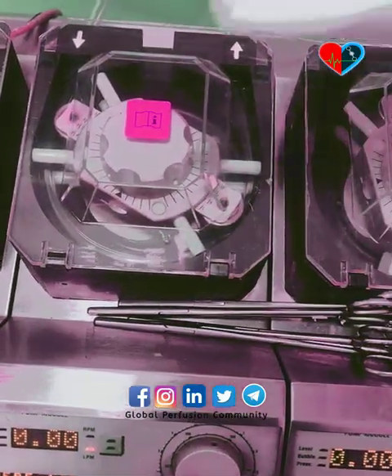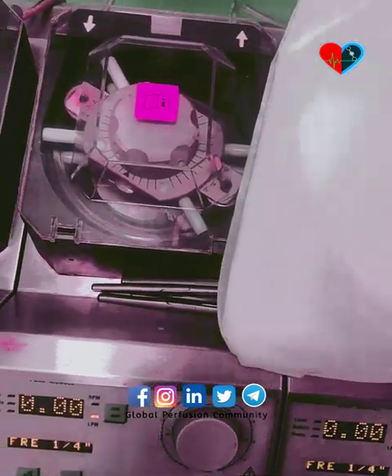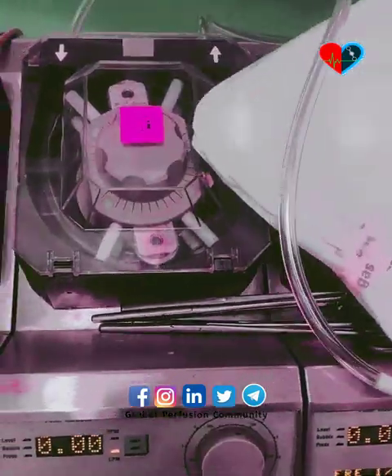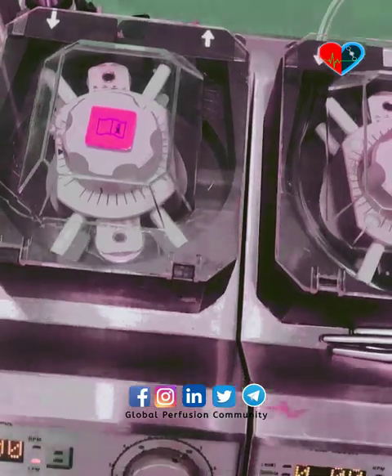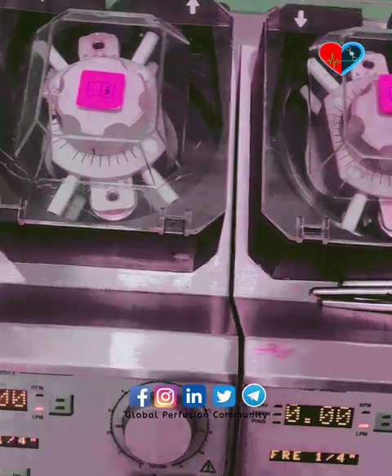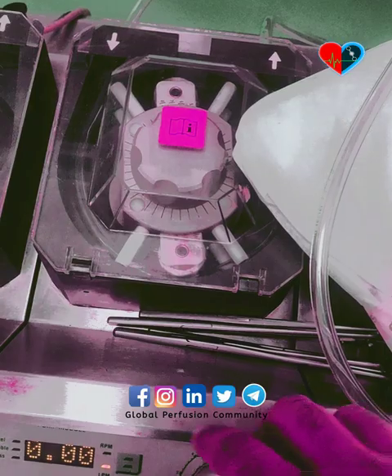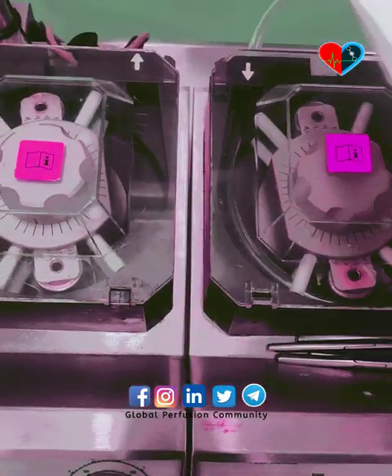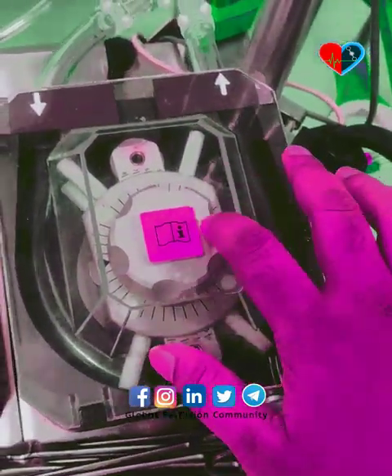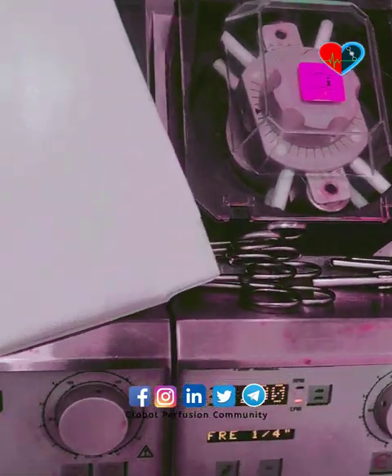This is a demo section which we have assembled. This tubing is used for suction, and these two pumps are mainly used for suction. During the surgery, whatever extra fluid and blood enters the thoracic cavity is sucked through these two pumps, then filtered and given back to the patient through the main arterial pump.